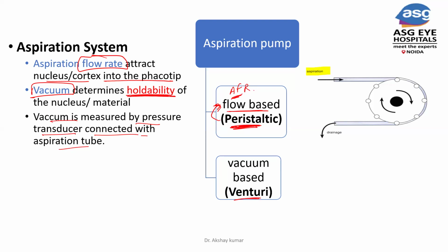And second is the Venturi. It directly controls the vacuum, so it is also called a vacuum-based pump.